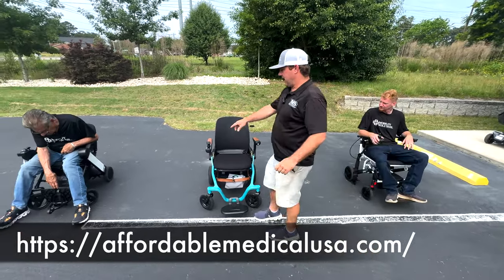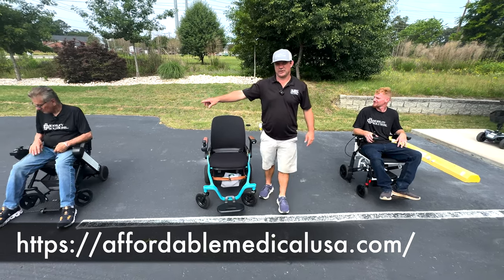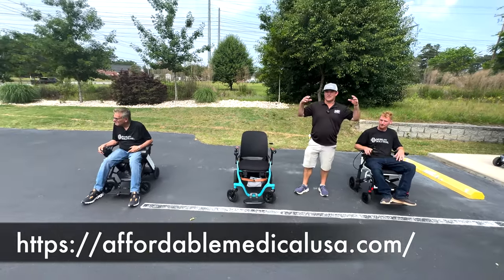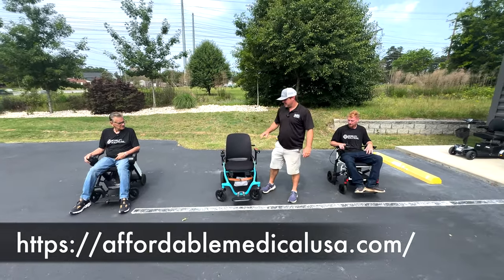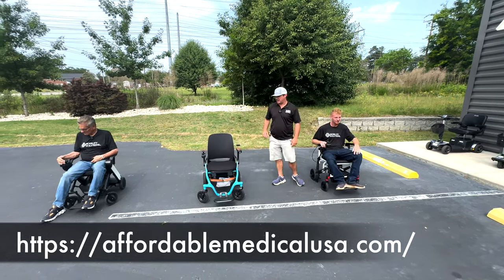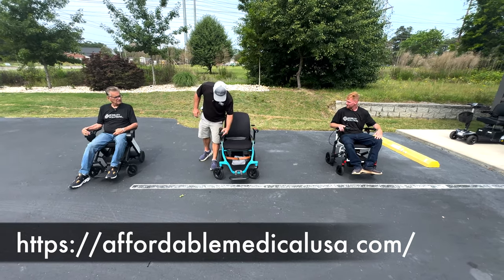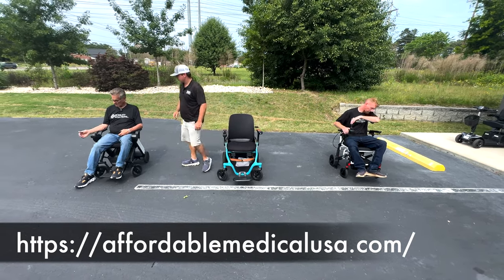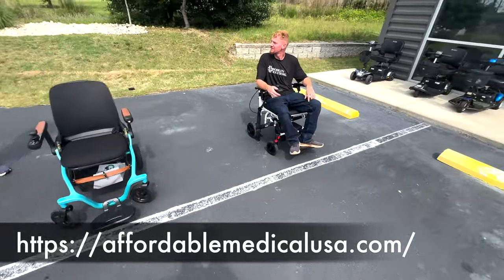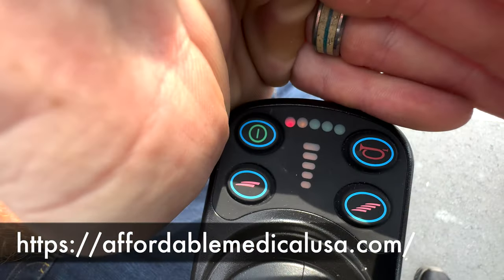Again, digital dash, voice. That one also talks to you if there's something wrong with it. Both of us have Bluetooth. This is just your standard. It's the sun's on us, a little bit of an overcast. This one's harder to see what speed you're at. This one's reasonable. This one's the clearest. So if you have a little bit of vision, you're probably gonna like the FI better.